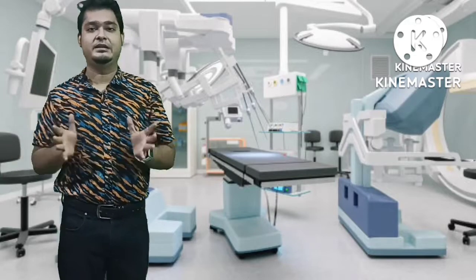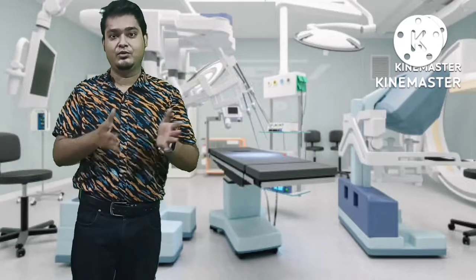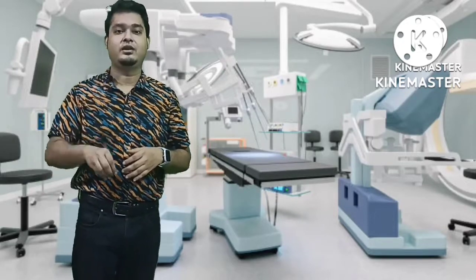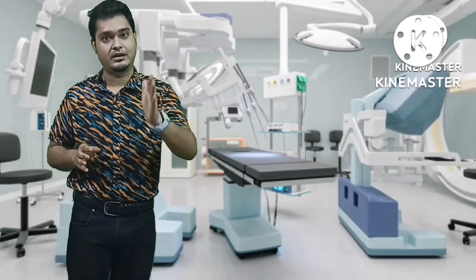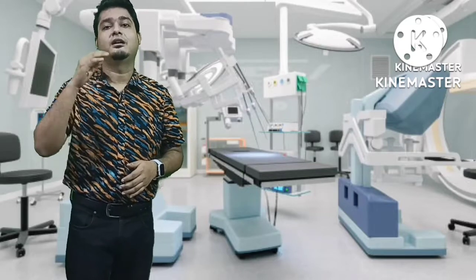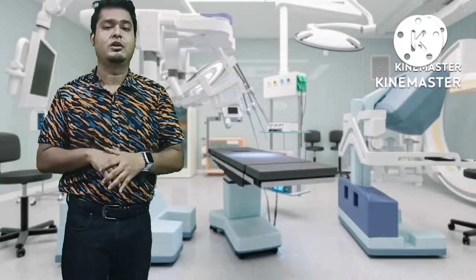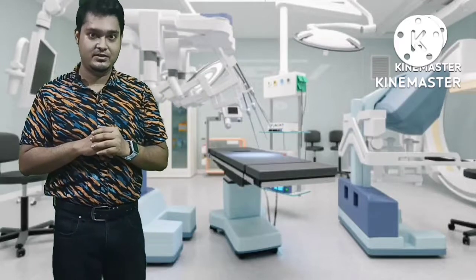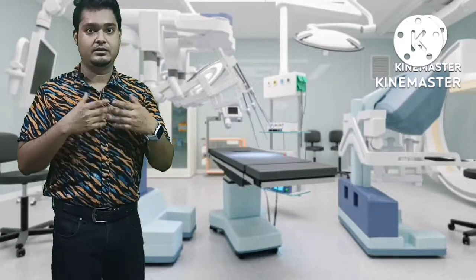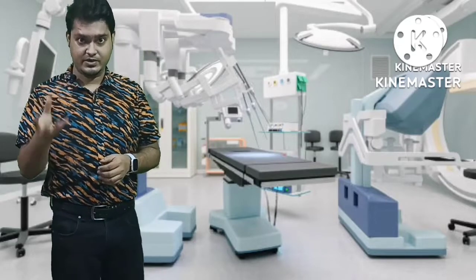Okay, so these are the main advantages and disadvantages. Basically, if the patient is already diagnosed with a heart blockage, we will go for the coronary catheter angiography, and if the patient is not properly diagnosed with a heart blockage, then it is better to perform the CT scan, which is less invasive. Also, CT coronary angiography is less expensive as compared to catheter angiography. Catheter angiography is a little bit expensive as compared to CT coronary angiography.